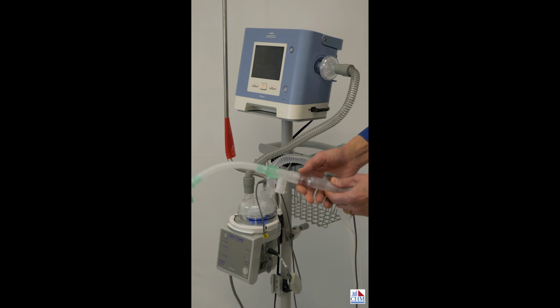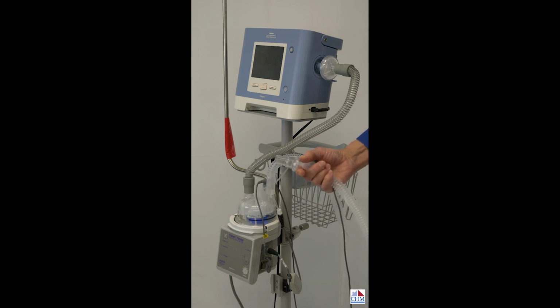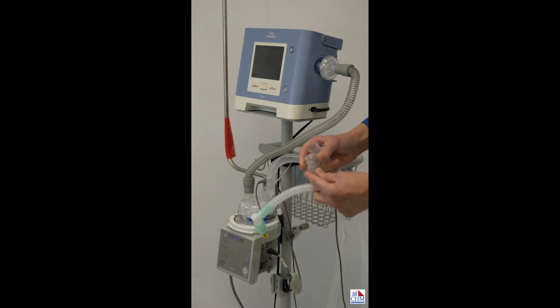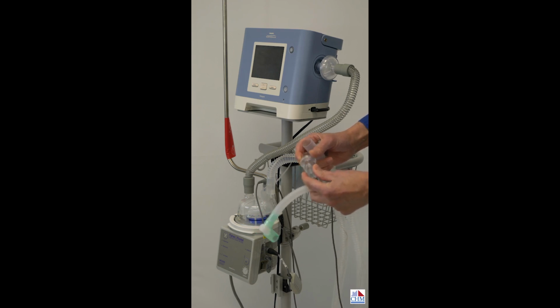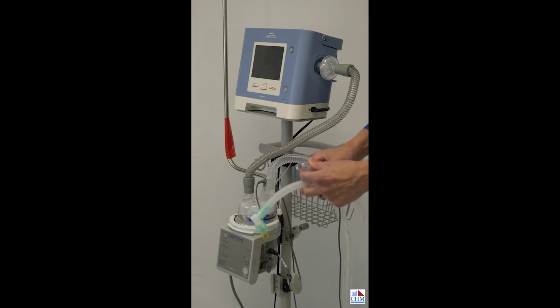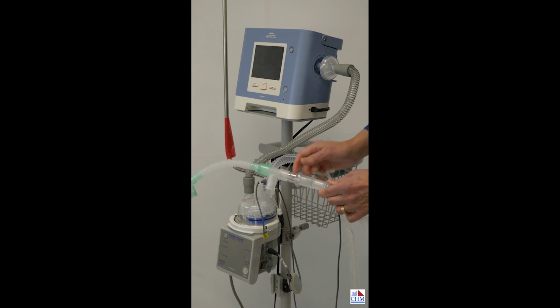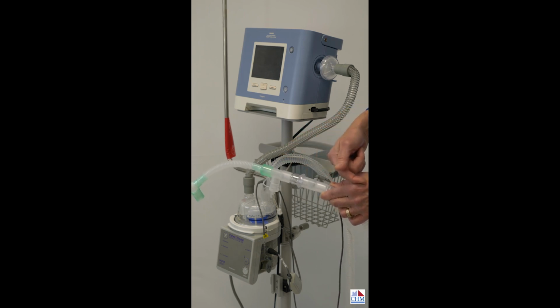And then at the end, what makes this a passive circuit is the fact that it has a leak built into it. And that leak is made with this device. It's called a whisper swivel. And the whisper swivel comes apart. If I pinch the ends of it here, I can take it apart so it can be cleaned. And it is what provides the leak. Now, if you'll notice the way I have it in the circuit, I have the flanges pointed this way. What that does is allow the airflow to go this way, away from the patient.